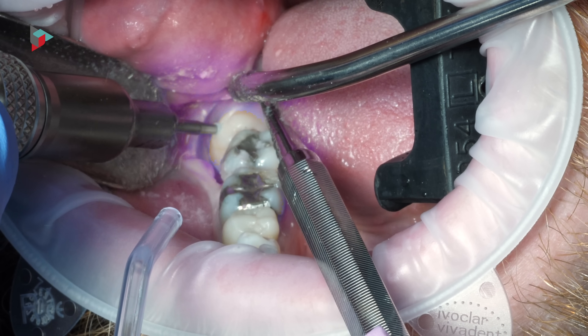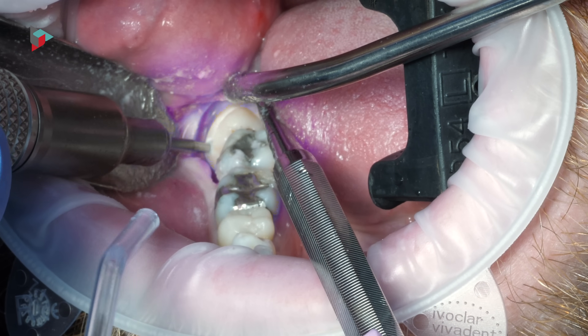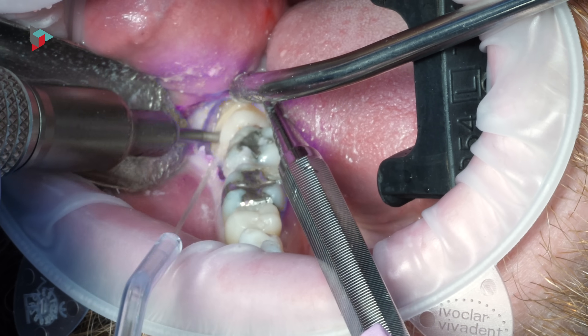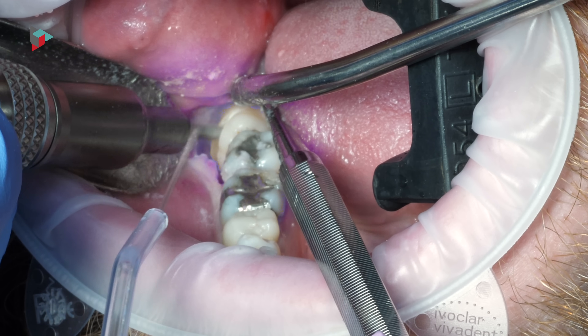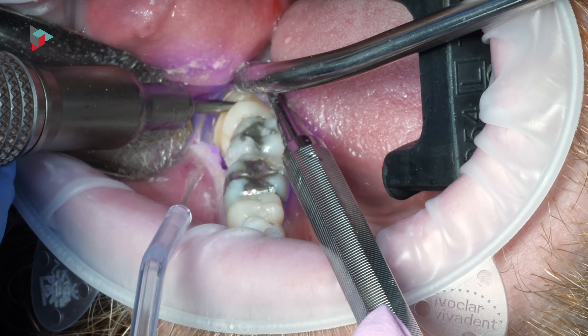However, there are instances when the surgeon may need to remove some of the surrounding bone in order to fully extract the tooth.